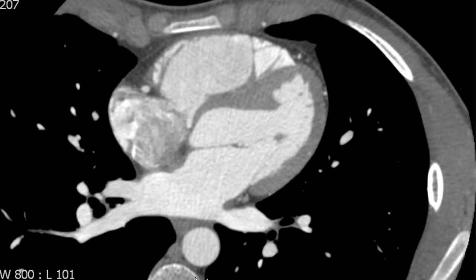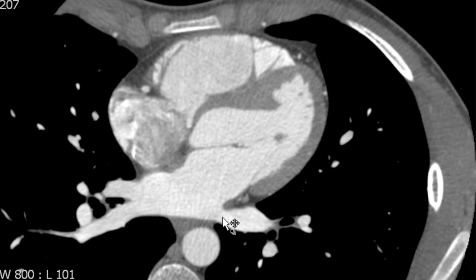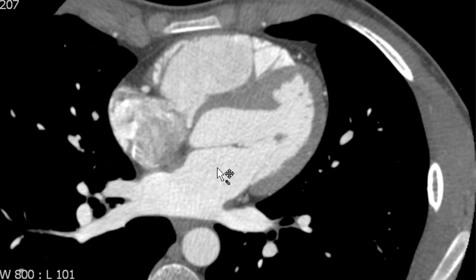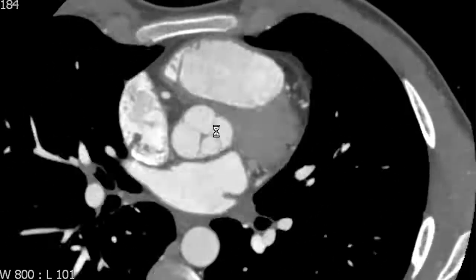At the inferior margin of the screen here, you can see a little bit of the vertebral body. The vertebral body is closest to the left atrium. So if you see a chamber — sometimes when you're presented in a case conference scenario with an unusual oblique projection — you may see a little bit of the vertebral body and then see a chamber near it, and that's a good landmark to help you identify the left atrium.